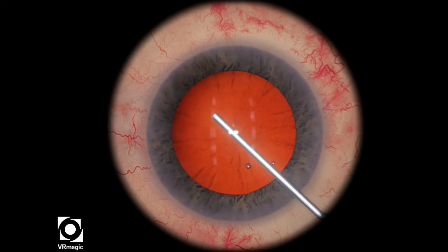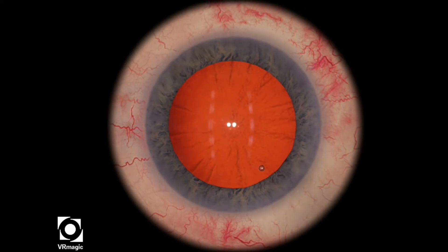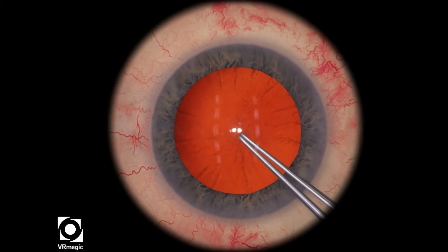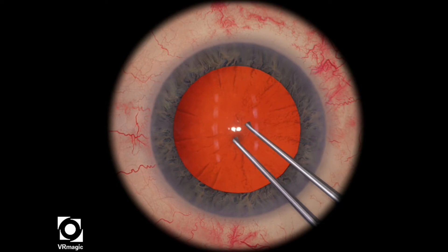In this particular level, you do not have the black circle to help guide how big your rhexis should be, so you have to use a bit of imagination and think about where the black circle was in the previous video.